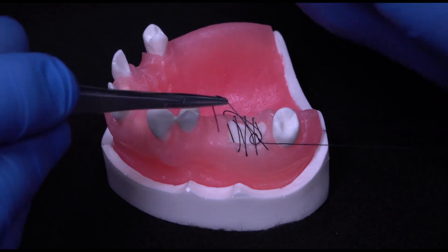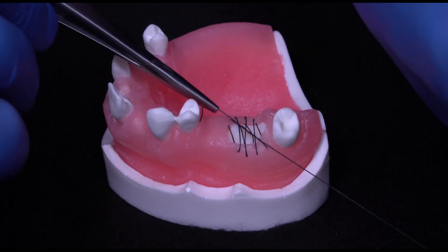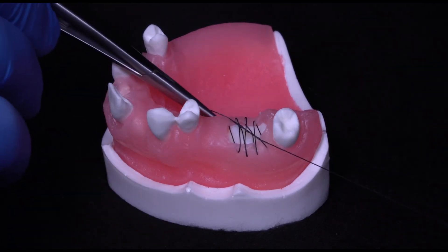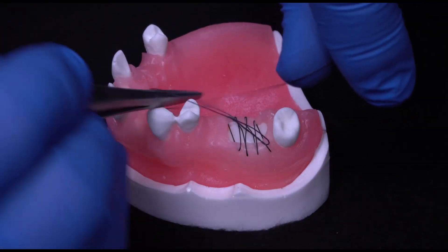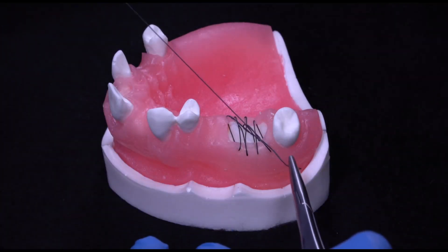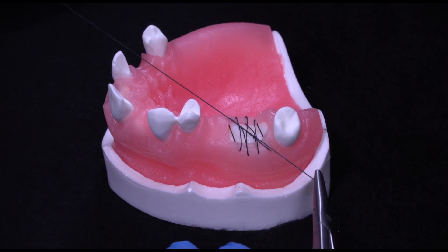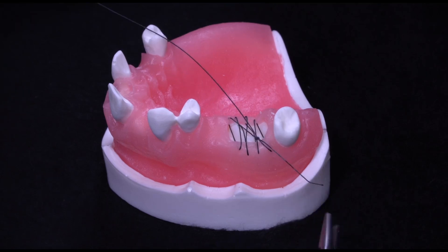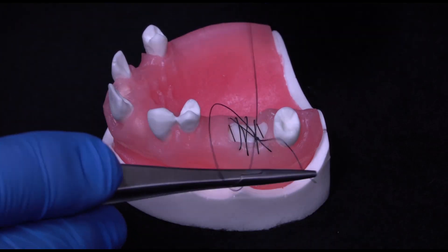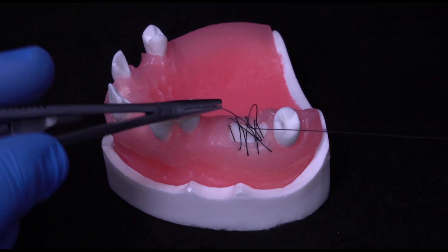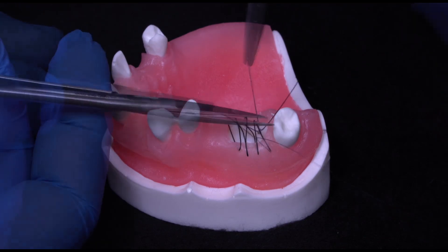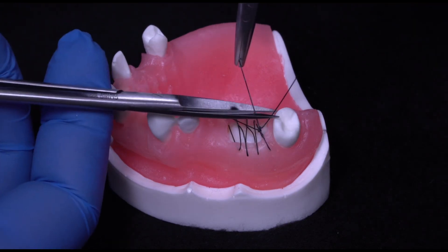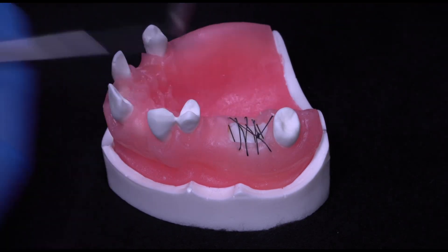Completing the suturing with a surgeon's knot will secure the suture in place, stabilizing the collagen membrane and containing the bone graft during healing.